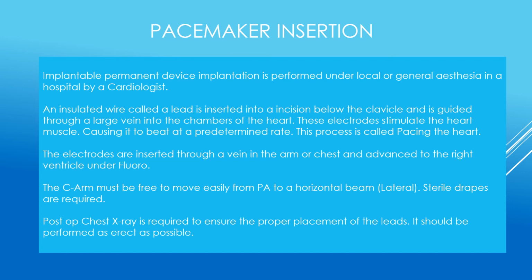Pacemaker insertion. An implantable permanent device implantation is performed under local or general anesthesia in a hospital by a cardiologist. An insulated wire called a lead is inserted into an incision below the clavicle and is guided through a large vein into the chambers of the heart. These electrodes stimulate the heart muscle, causing it to beat at a predetermined rate. This process is called pacing the heart.